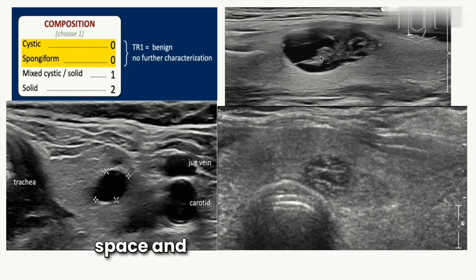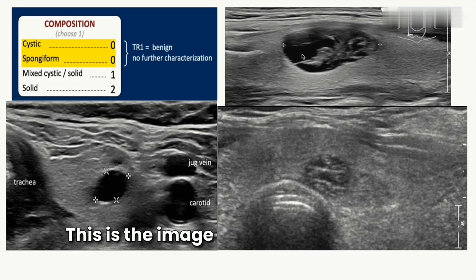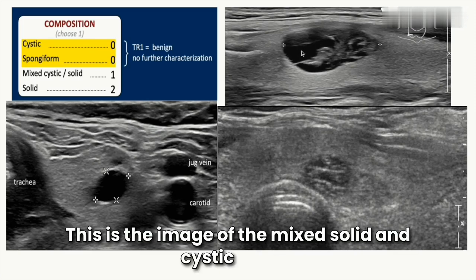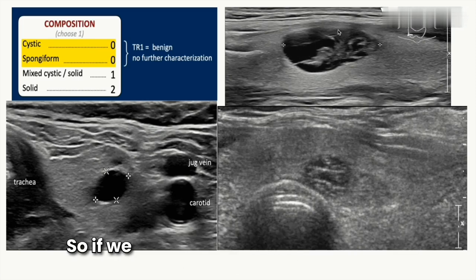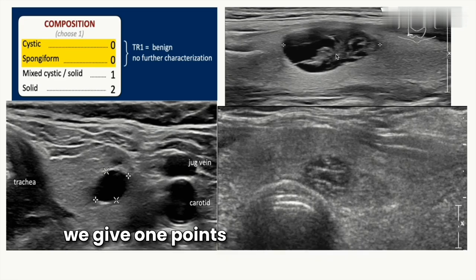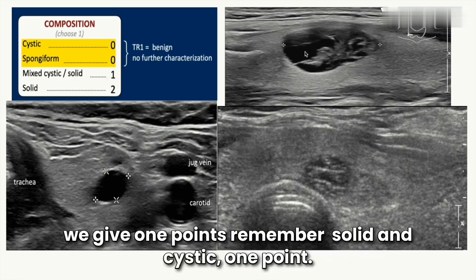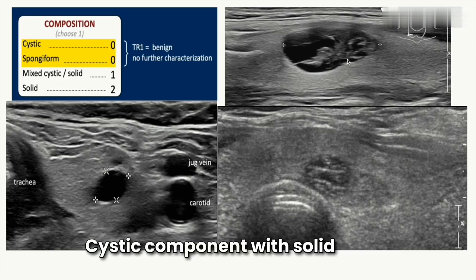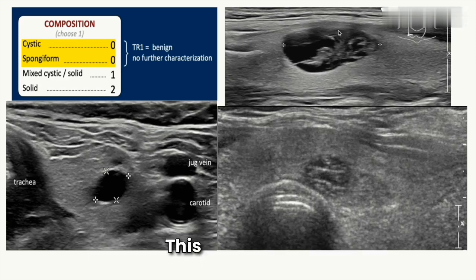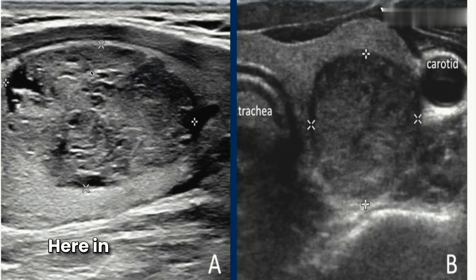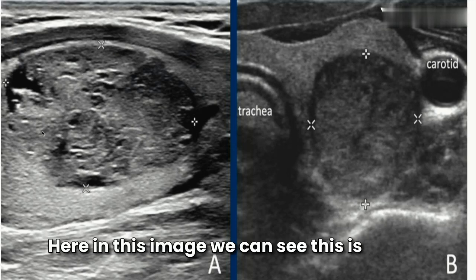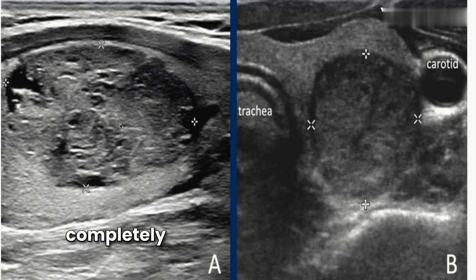Here we can see the cystic space and the solid component — this is the image of a mixed solid and cystic lesion. If we see this type of image, we give one point. A mixed solid and cystic lesion, or a cystic component with solid parts, scores one point.